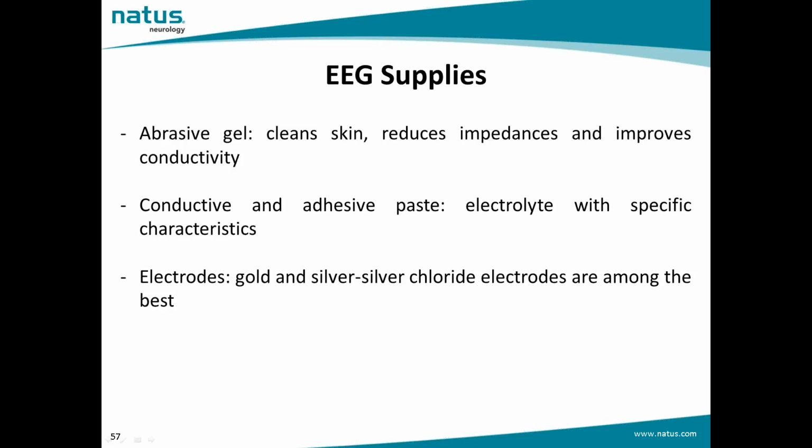When metal is placed in contact with an electrolyte, a voltage develops between the metal and the electrolyte due to the formation of a layer of electrical charge on the surface of the electrode. Different metals generate different voltages with the same electrolyte.